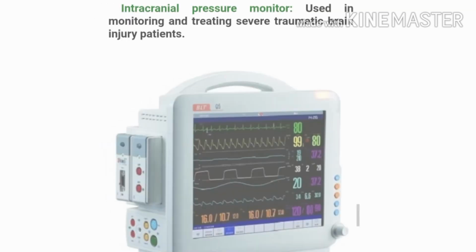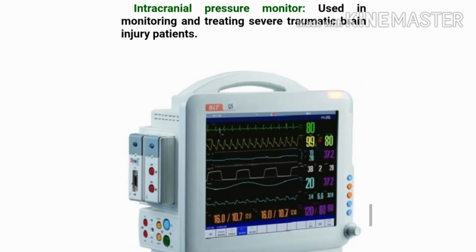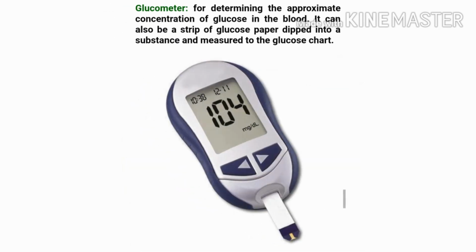Electroencephalography. And this is the image of the intracranial pressure monitor. As you can see the image very clearly, it is used in monitoring and treating severe traumatic brain injury patients.